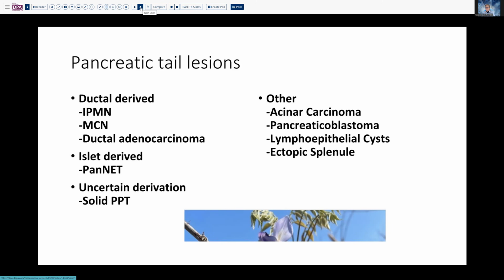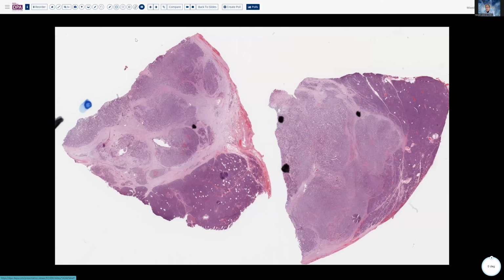That may lead then to a biopsy. The biopsy in this case disclosed what looked like a neuroendocrine tumor. So that was prompted by evaluation as to resectability and so forth, functionality, those kinds of things. And this was the result of that resection. We can see here normal pancreatic parenchyma on the periphery. And then we see this neoplastic proliferation interfacing with this in various ways. And also here, we see an element of the duct that is involved.